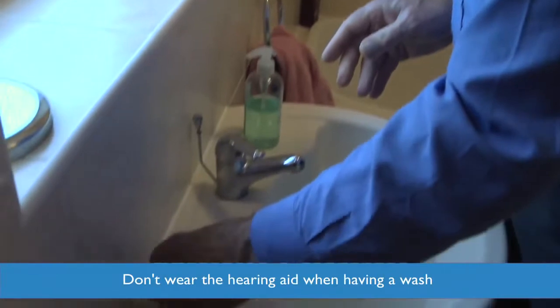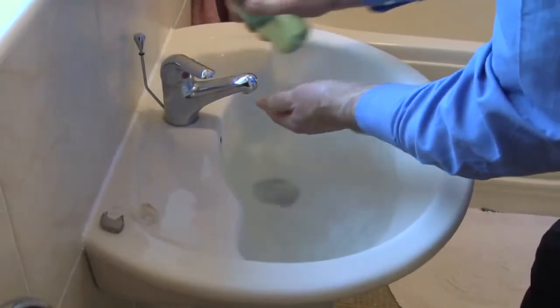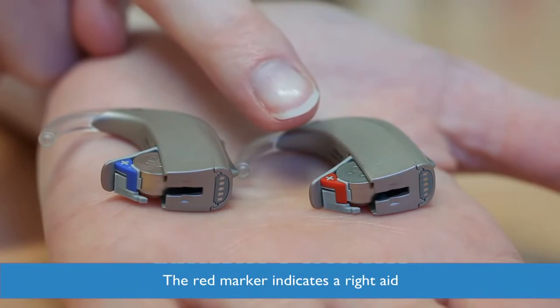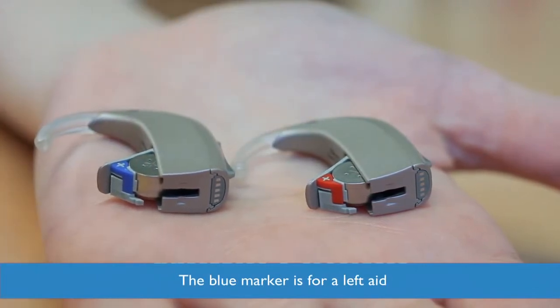Don't wear the hearing aid when having a wash, as the electrical parts should not be exposed to water. There is also a coloured marker in the battery drawer of your hearing aid. The red marker indicates a right hearing aid and the blue marker is for the left.